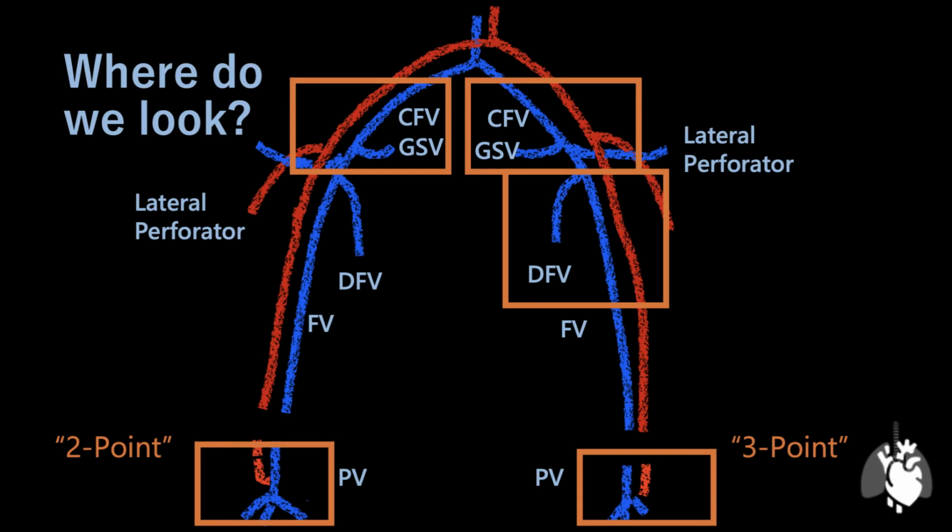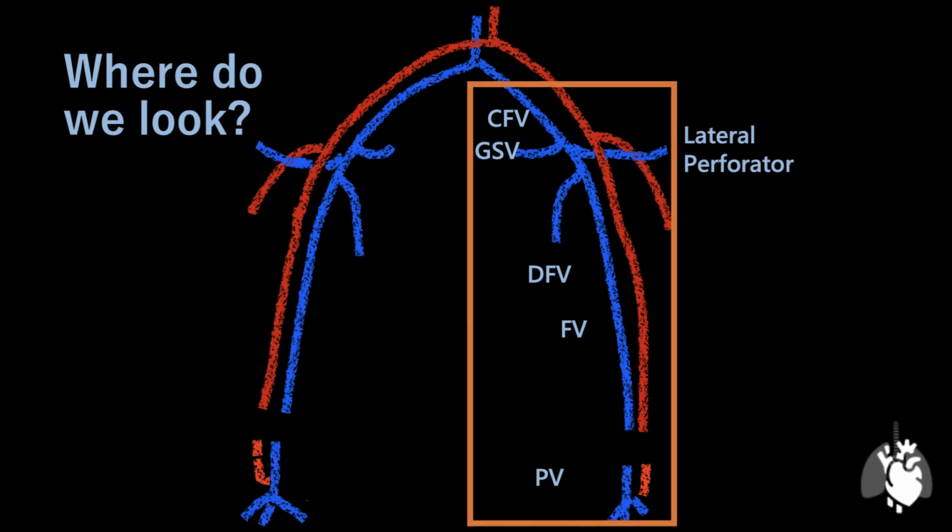Venous thromboembolism is a high-stakes diagnosis, and POCUS users are already disadvantaged by not having the same volume experience or application of advanced techniques that radiology techs and radiology departments have. So why add sensitivity limitations from the protocol as well? Anyway, that's just my thought. But I would advocate for the internal medicine ICU context, compress the entire accessible deep venous system with special attention to the points of venous confluence.